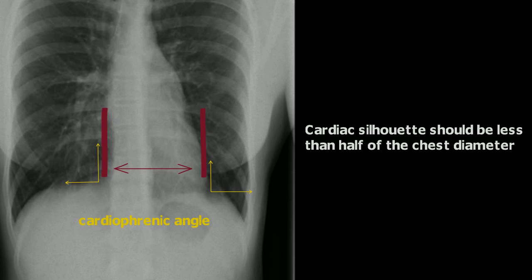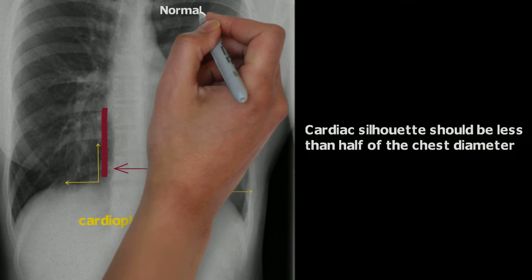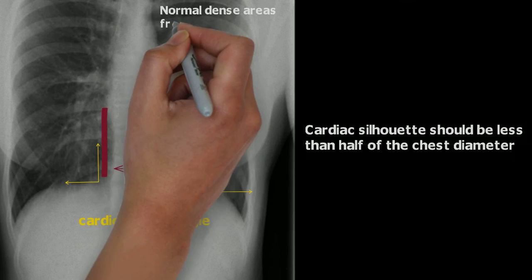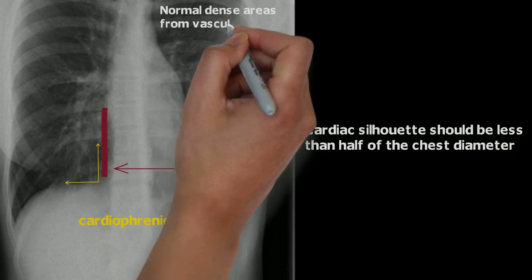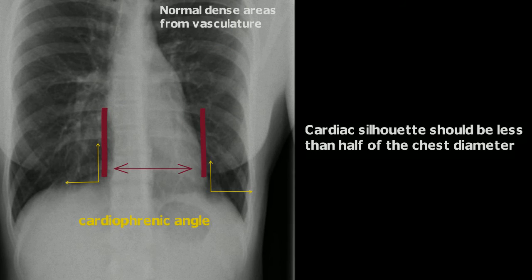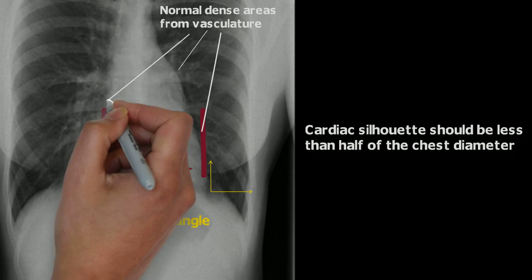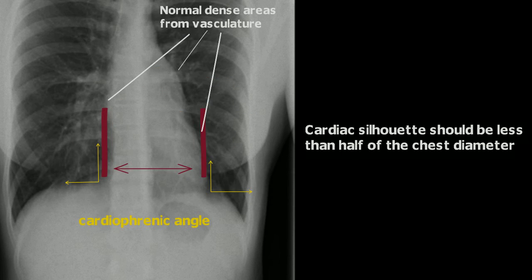Your health history and exams should help you narrow down the differential. As you review the rest of the cardiac silhouette edges, you'll see prominent, dense, lumpy areas. These are normal and represent different parts of the cardiac anatomy. Although not visible in this picture, it's common to see this on the right side as well, from the right atrium and ventricle.